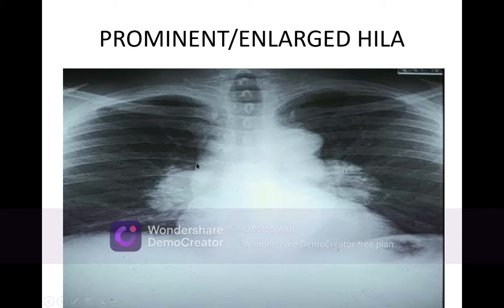Now, this line is of the mediastinum. This is the mediastinum, upper part. It is a large one. You see the lines, they are not regular, and it is because of paratracheal lymphadenopathy. And this is the trachea, and afterwards the haziness, which is parallel to it, is the paratracheal lymphadenopathy. Both sides are involved here, although there are other findings as well.